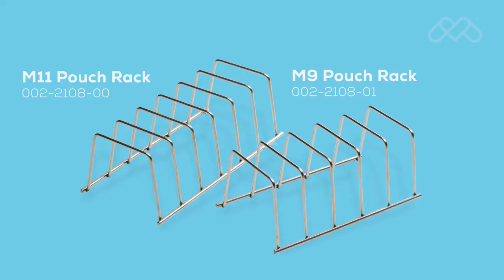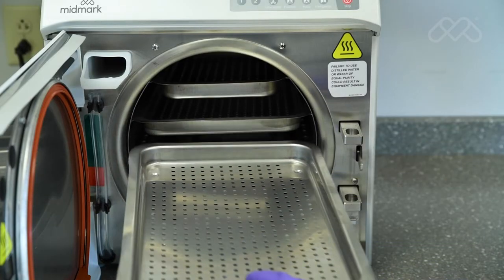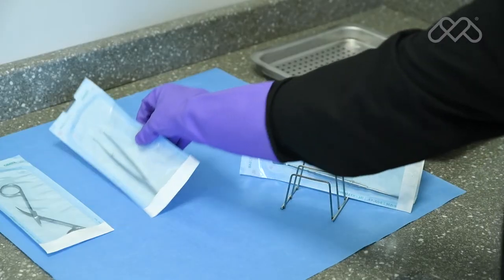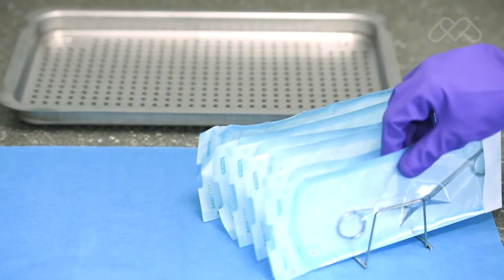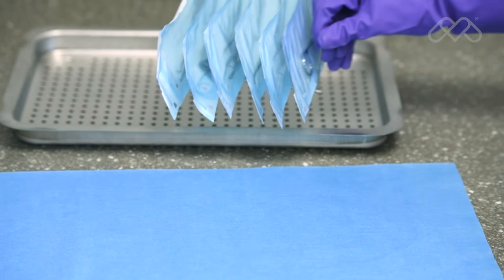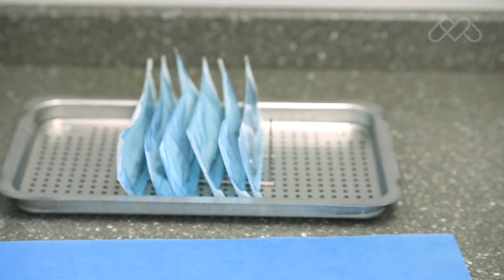Additional pouch racks can be ordered if needed. If more than two pouch racks are used in a single load, additional dry time may be required. Use of the pouch rack requires the removal of some of the sterilizer trays. When using the pouch rack, load a single pouch per rack slot. When using paper or plastic sterilization pouches, the pouches should be oriented in the rack so the plastic side of one pouch faces the paper side of the adjacent pouch.